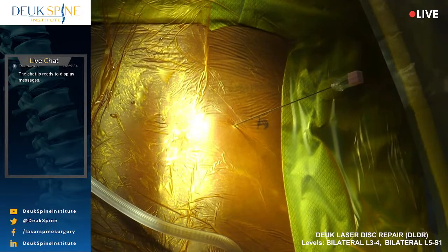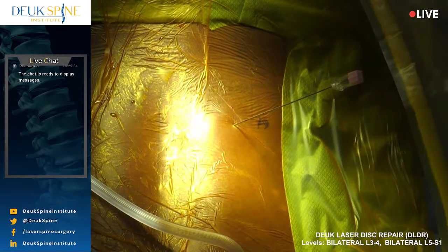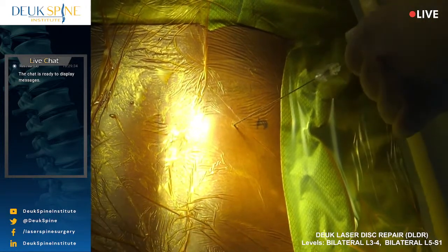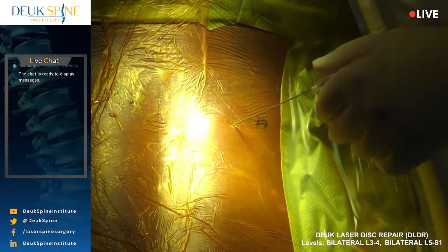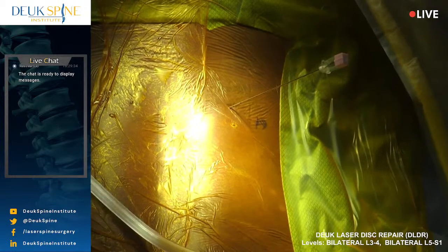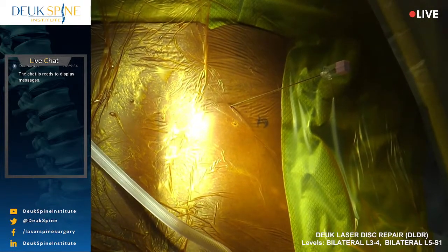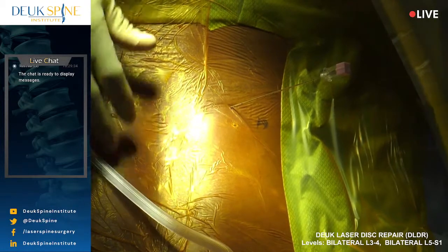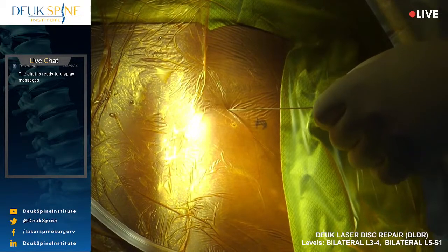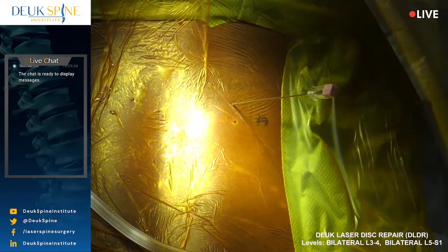All right, so we're a little higher than I want to be. Wow, is that rotated that much there at 3-4? You see that? How's blood pressure? Coming down. It's hard to get down. Luis, you agree we're at 3-4? 4-5 there. You're doing good. Just relax. Everything's okay.